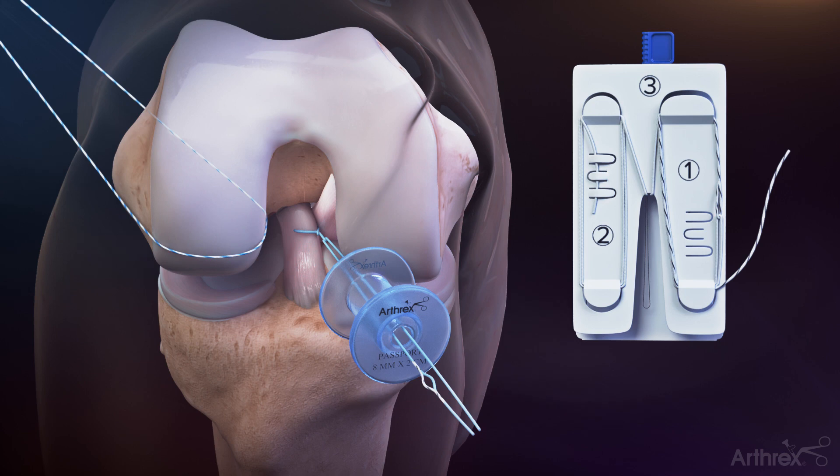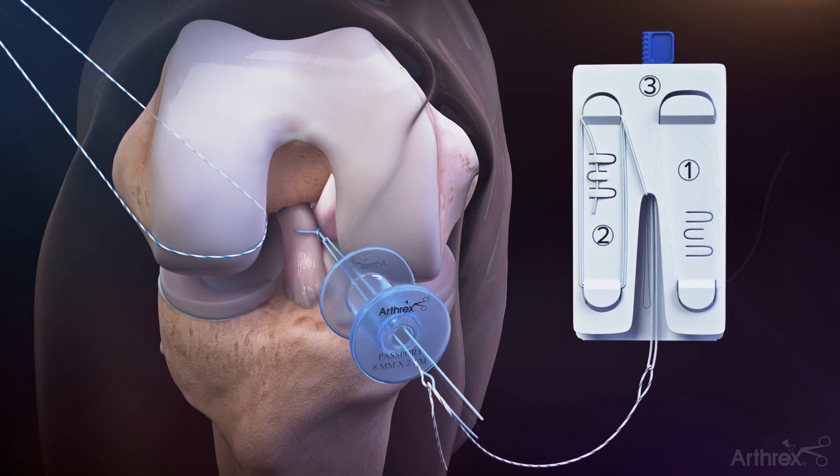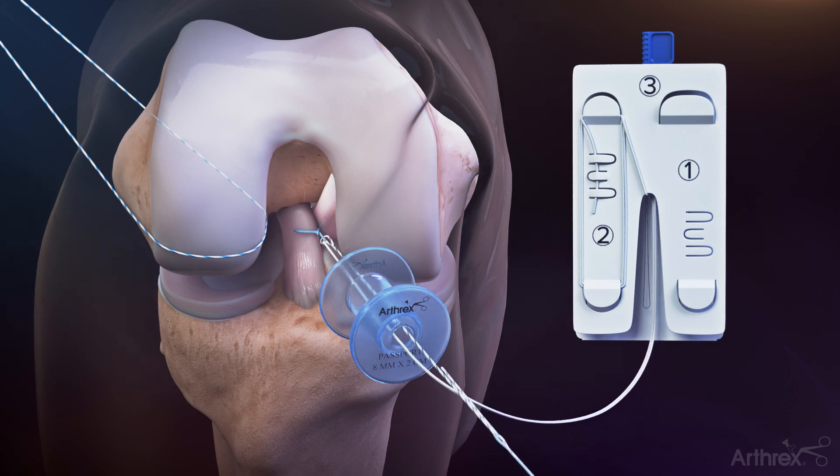Unravel the tiger wire leader suture on the ACL repair tightrope implant assembly card and load approximately two inches into the suture eyelet of the fiber ring shuttle loop. Pull the blue tail of the fiber ring shuttle loop to shuttle the leader suture through the luggage tagged fiber ring suture and back out the passport button cannula.